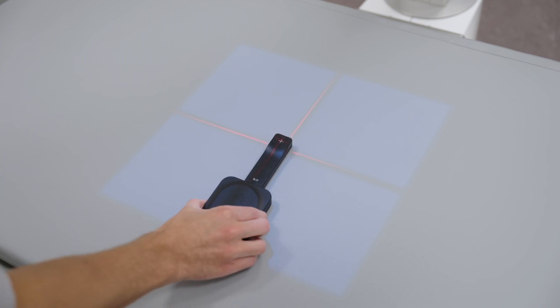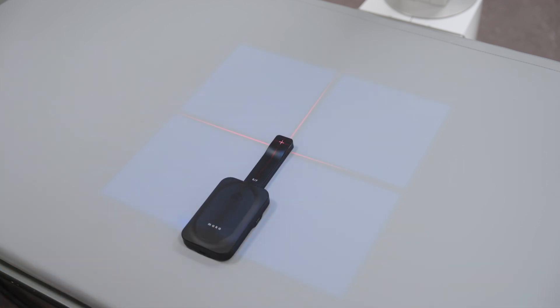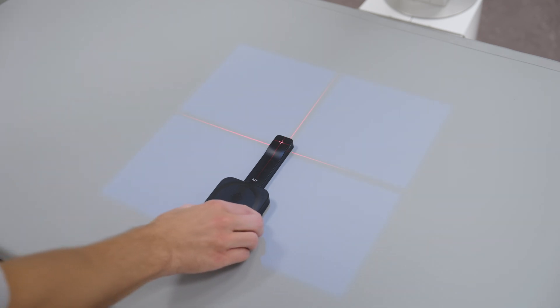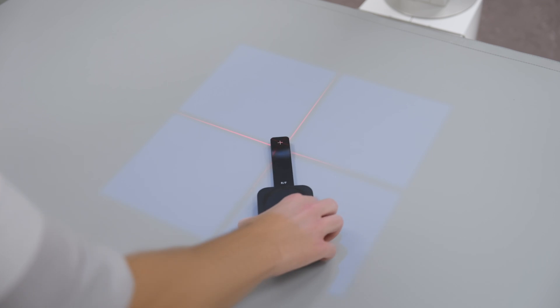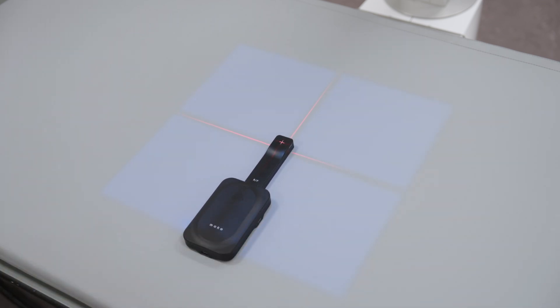Place the Mako RF probe into the correct position for x-ray measurement. The crosshair denotes the detector area. Use the light field as a guide to position the detector in the centre of the x-ray beam. Thanks to its advanced design, the probe can be placed in any orientation under the x-ray beam. No alignment checks or settings are required.